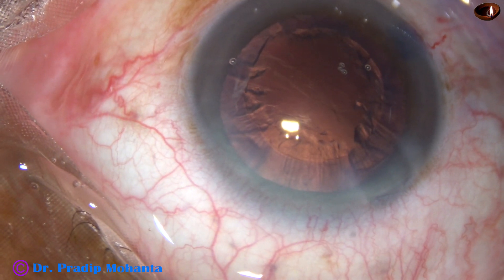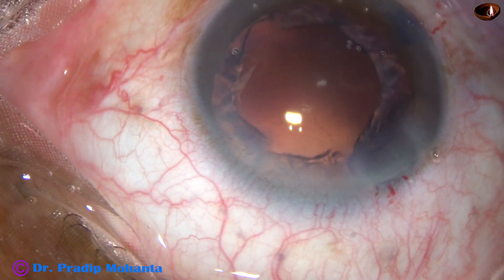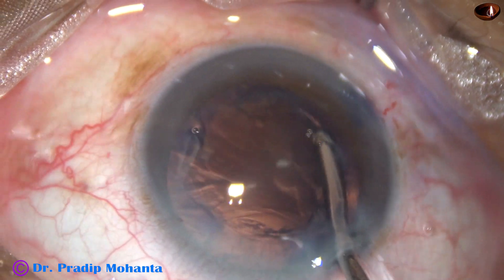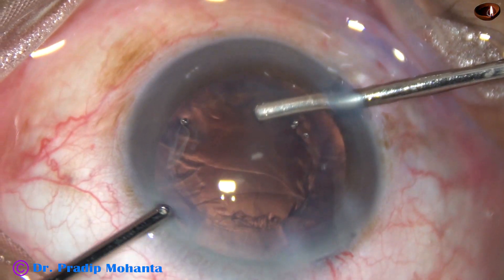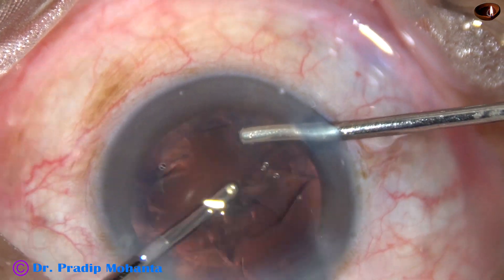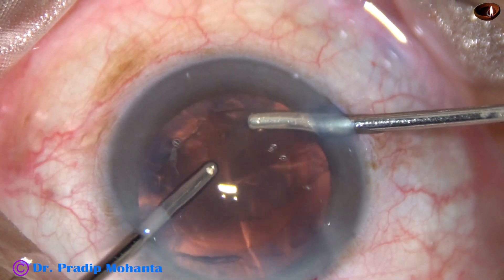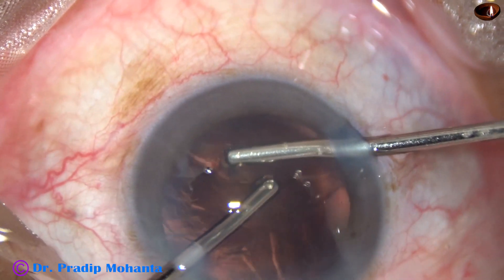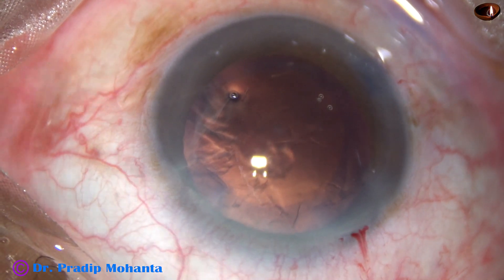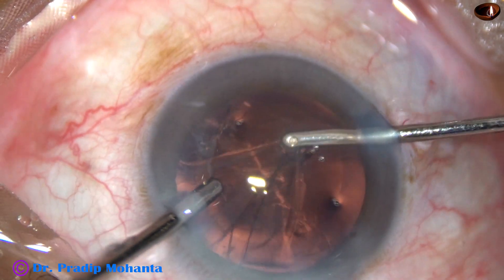The nucleus has been emulsified. Viscoelastic is injected to fill the capsular bag and the anterior chamber. Bimanual irrigation-aspiration is used for removal of cortex — vacuum is 300, flow rate is 30, with irrigation from the right side port and aspiration from the left. The cortex is found to be sticky and is coming out slowly. Cortex removal is carried out from 6 o'clock, then 9 o'clock positions.